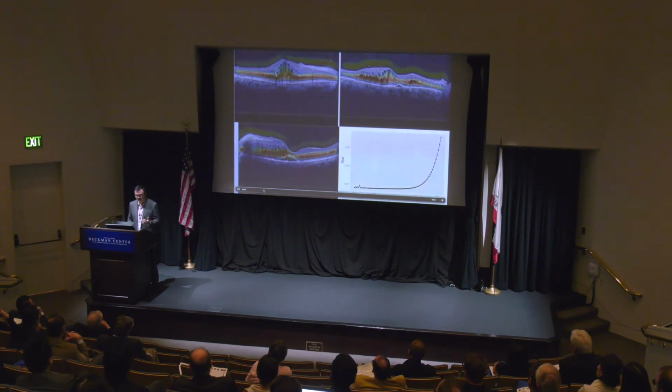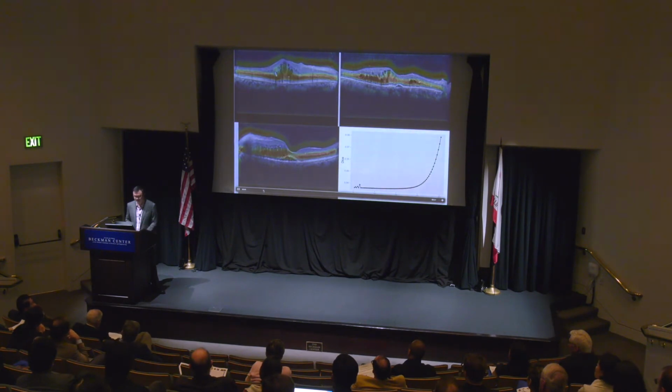It emergently kind of learned that in order to solve this problem of finding the intraretinal fluid cysts, it had to solve this other problem along the way. And that's kind of crazy because we literally just fed it where the intraretinal fluid cysts were. And this is very similar to the way that I teach residents how to find intraretinal fluid, which is to identify the anatomic borders. And it had learned to do that emergently without us teaching it to do it on the way.